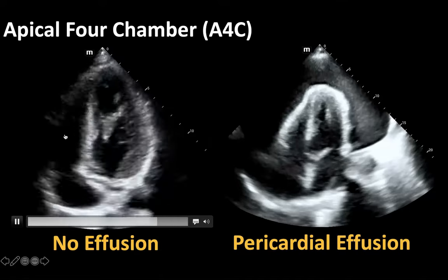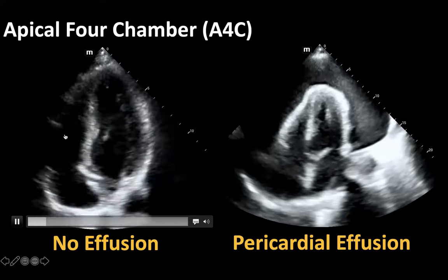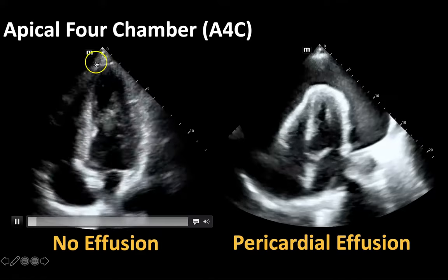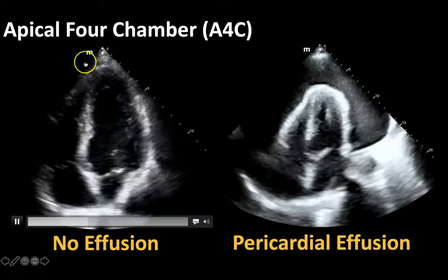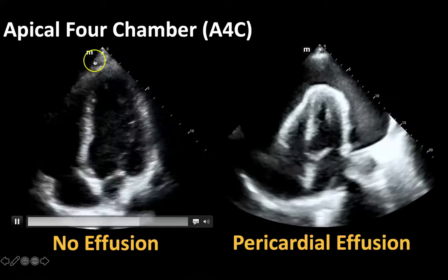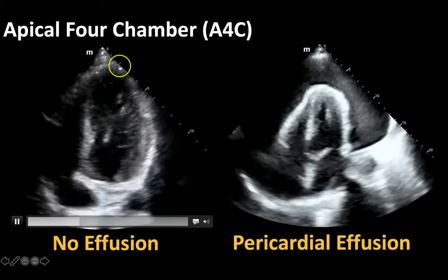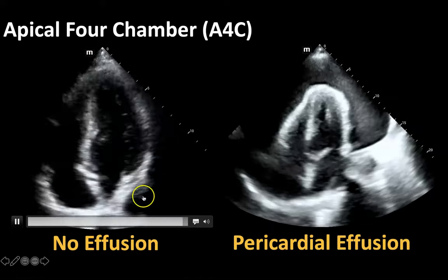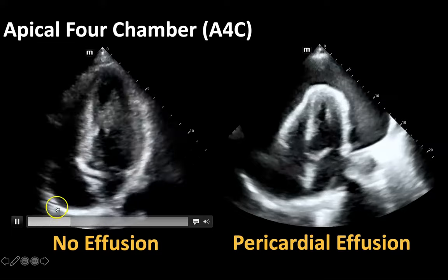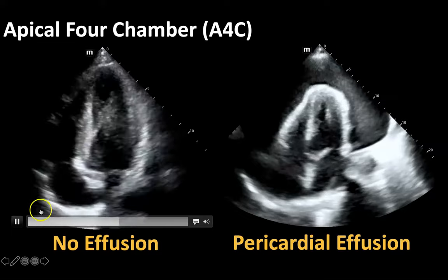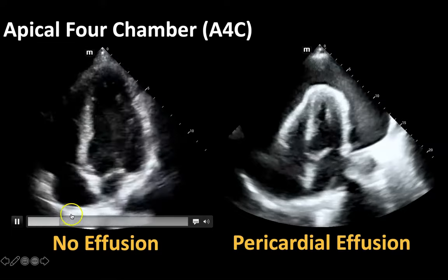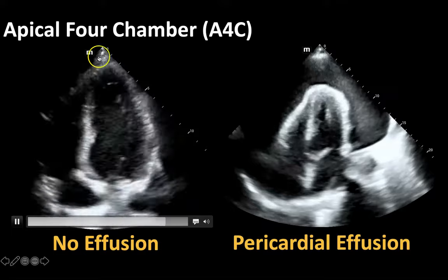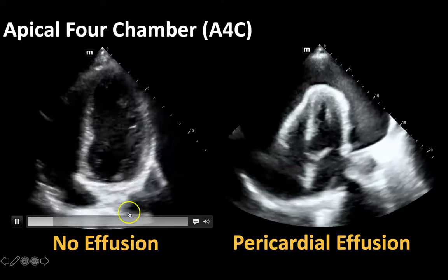When we look for effusion we're really just looking at the outside of the heart. We're looking anteriorly — do we see a black stripe or fluid anteriorly? Then we look all the way around the heart for any sort of black stripes, seeing if there's any circumferential pericardial effusion, which I do not see in this heart on the left side of the screen.